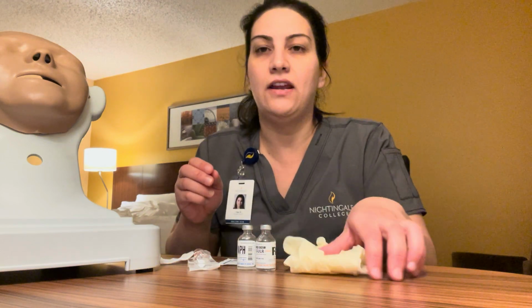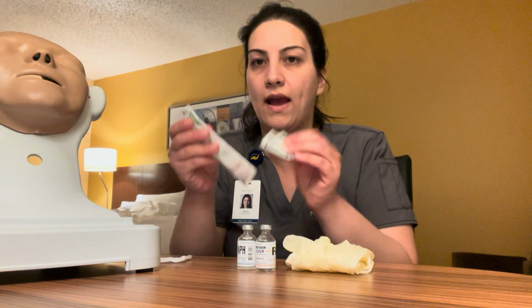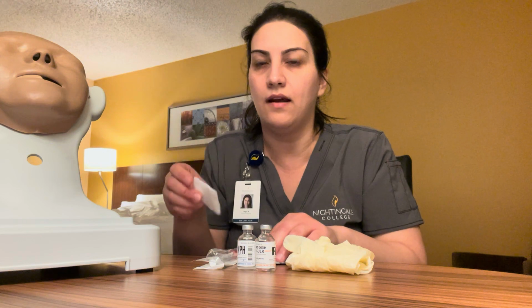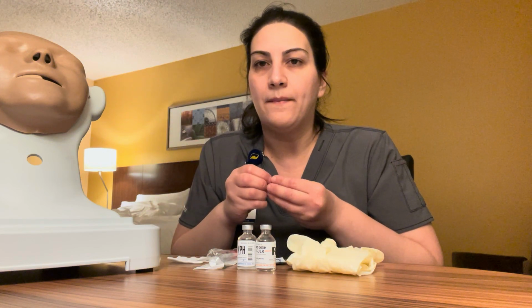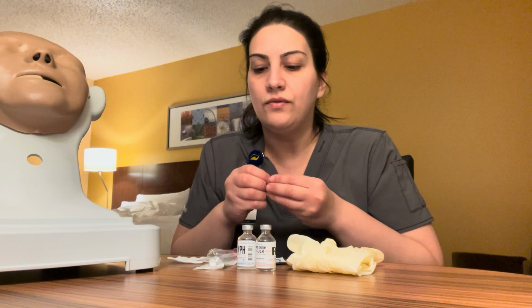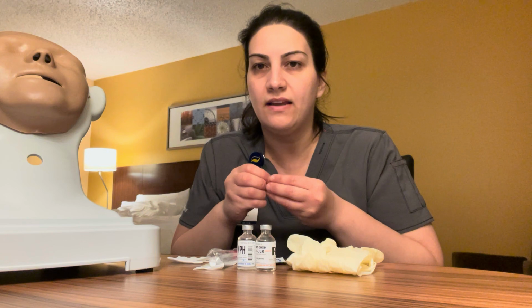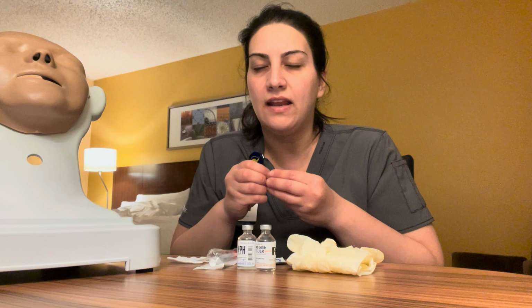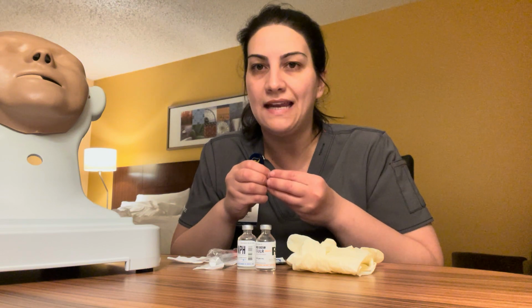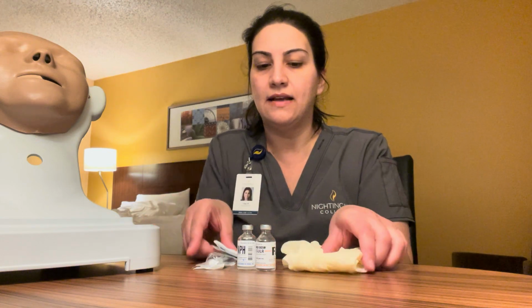Supplies here for this video would be a pair of gloves, syringe and needle, 2 alcohol wipes, and cotton wipe if needed. So as I stated before, patient is going to be receiving 4 units of regular and 8 units of intermediate NPH, equalizing 12 units for my patient subcutaneously. I'm going to go ahead and gather my supplies here.